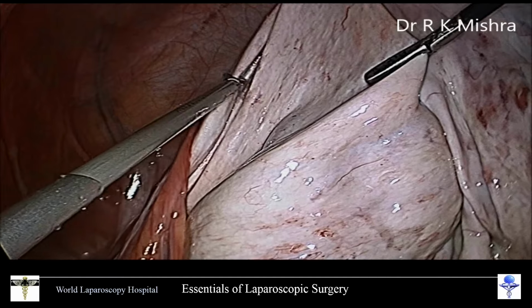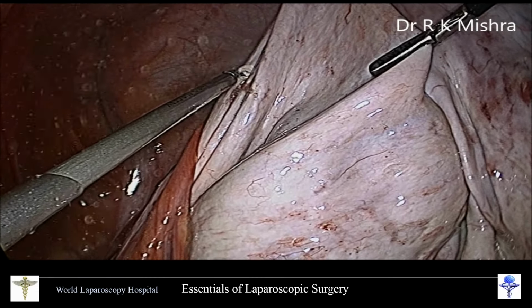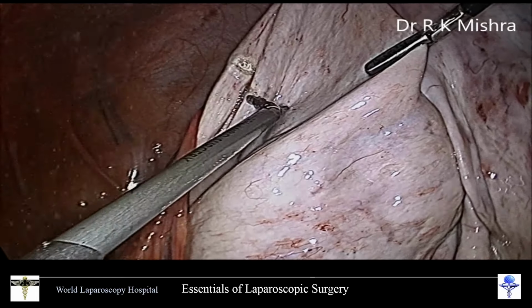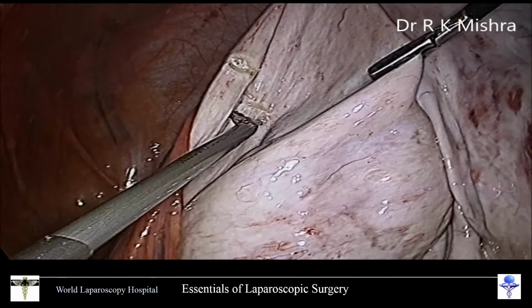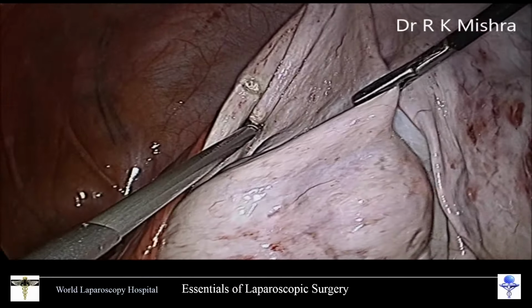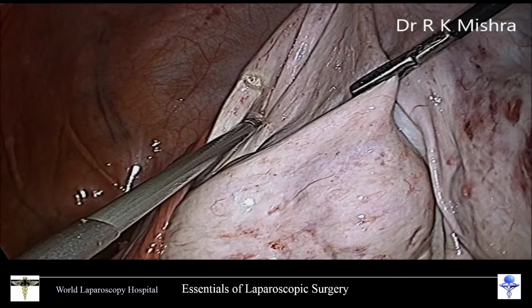If you have a suspicion of mucinous cystadenoma, fertility-sparing oophorectomy has to be performed, because the other ovary is okay, that will take care, because if you are leaving the cyst, there is a fair chance of recurrence, and moreover ovarian function cannot be confirmed.